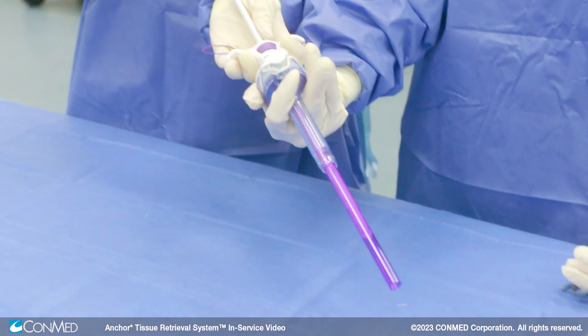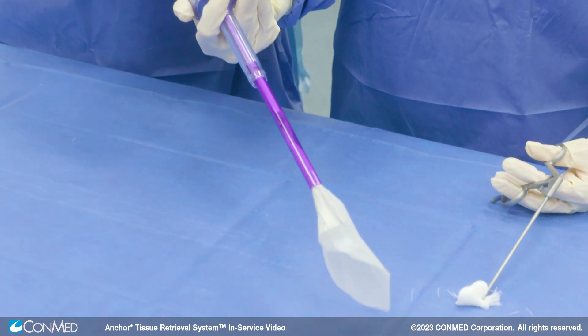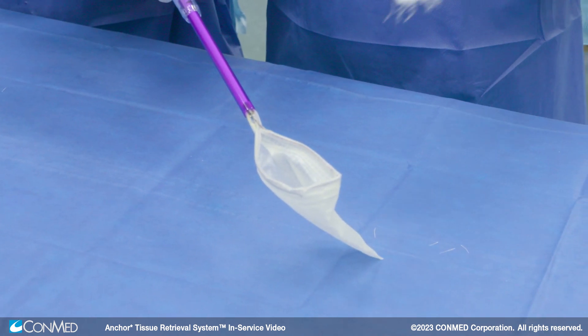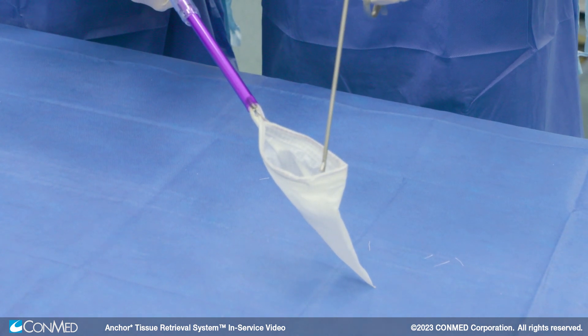Once the device is fully inserted, push the plunger in to deploy the ripstop nylon bag. The bag will open and unroll automatically. Once the bag has been deployed, place the specimen into the bag.